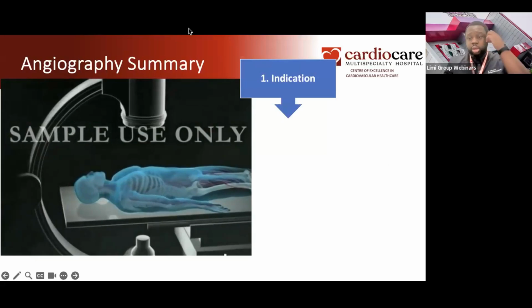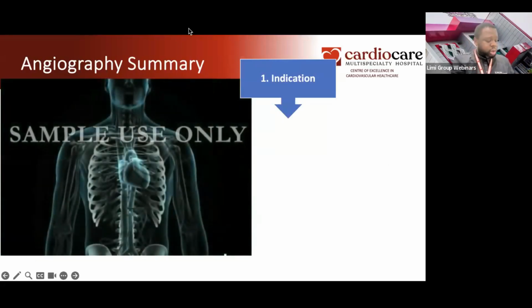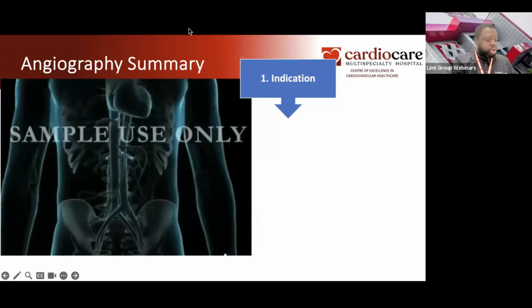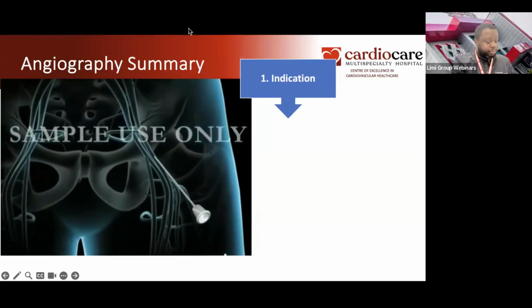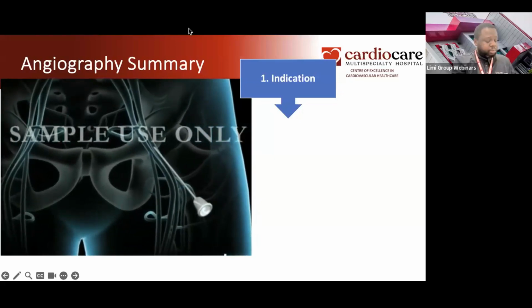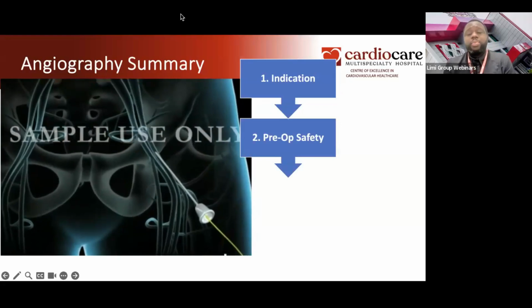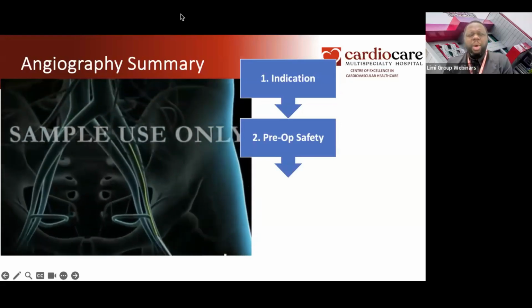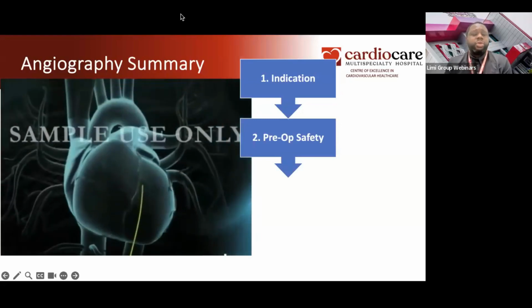and what will these indications show. So the indications, chest pain and the like, are all of them there. Then we now go on to the pre-op safety. So there are a number of things that must be done to make sure that it is a safe procedure.